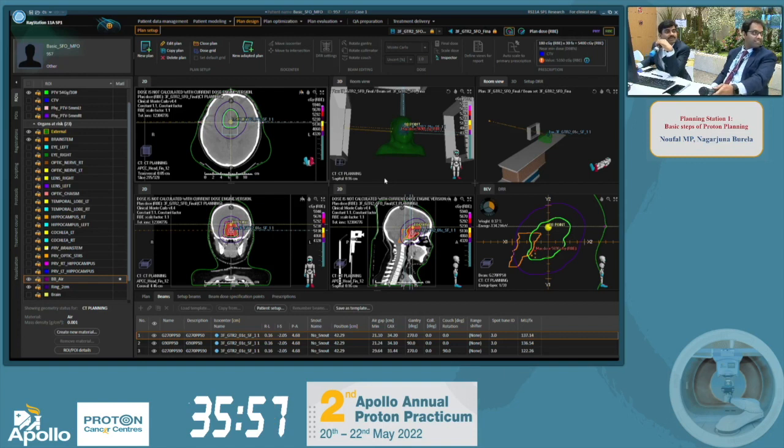I will add something to this. In the very beginning we struggled a lot, because we have to get all the details of a particular material, and sometimes we get it, sometimes we don't. But at least we try to get the brochures, go through their website, and extract all the information, and we started building up our own library.